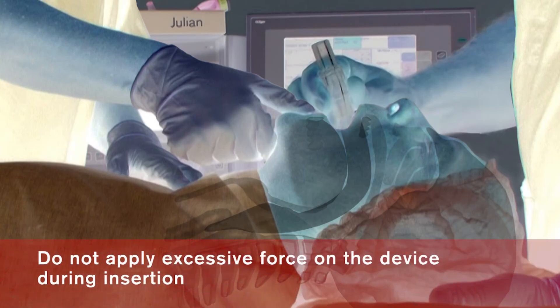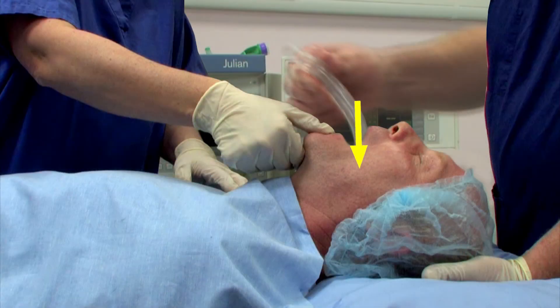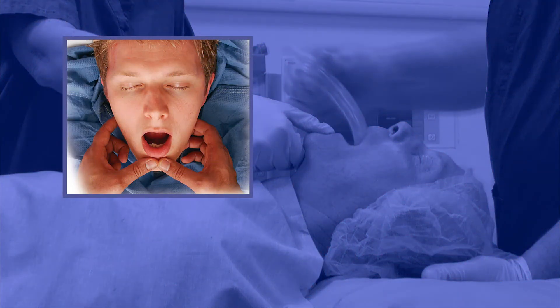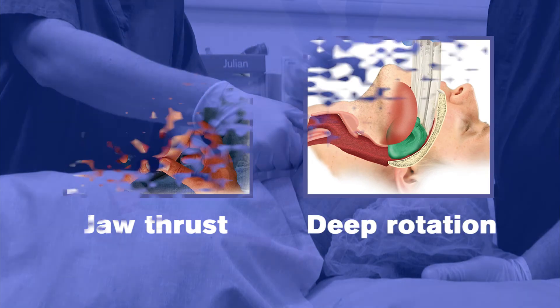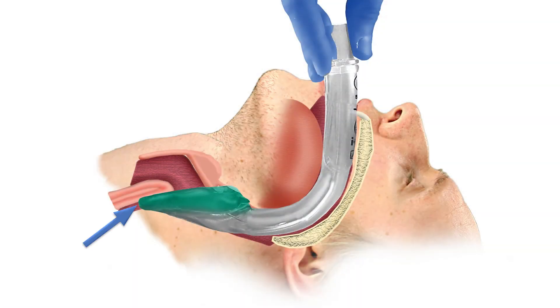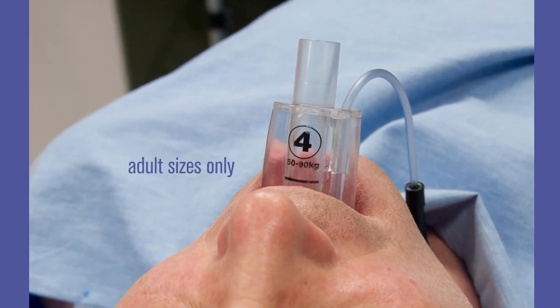Do not apply excessive force on the device during insertion. It is not necessary to insert fingers or thumbs into the patient's mouth during the process of insertion. If there is early resistance during insertion, a jaw thrust or insertion with deep rotation is recommended. When inserted to a definitive resistance, the tip of the iGel should be located into the upper esophageal opening and the cuff should be located against the laryngeal framework. The incisors should be resting on the integral bite block.